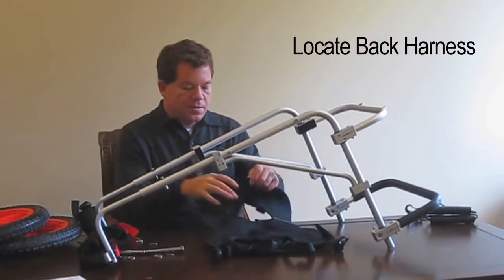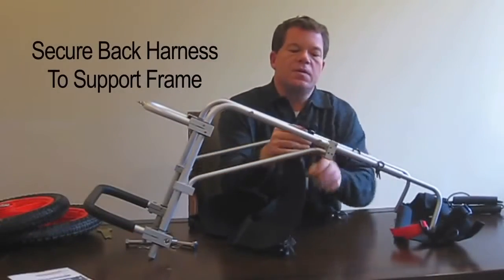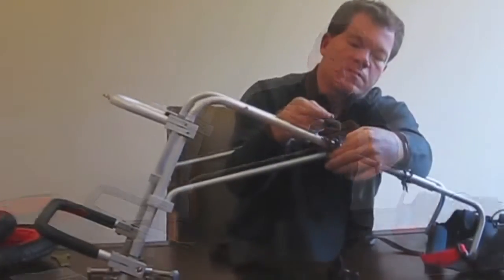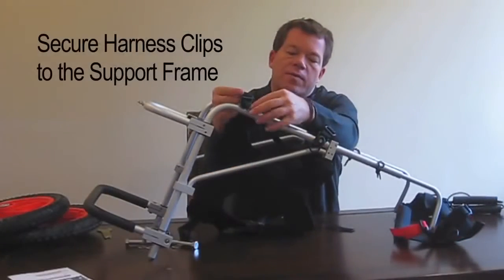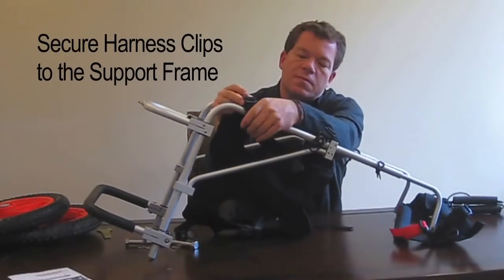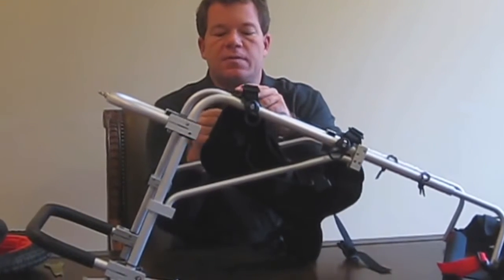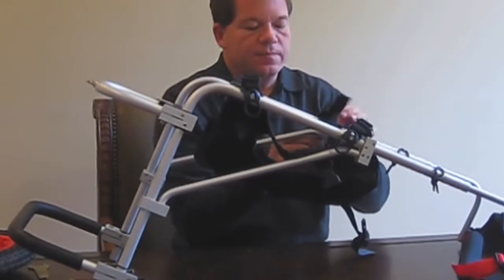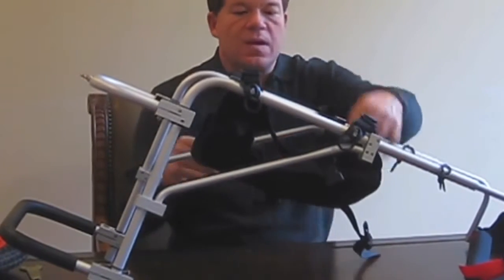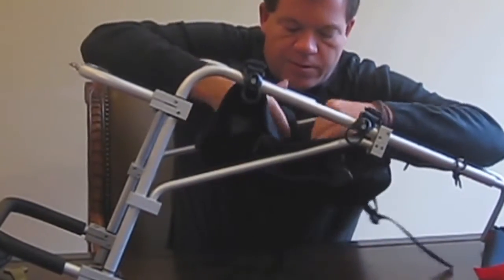Now we're ready to install the back harness. Go over the bar and snap it in, then repeat — over the bar, snap. Continue for each connection point — over the bar and snap. Now this is ready for the pet to go into.